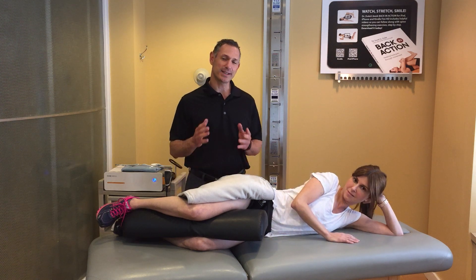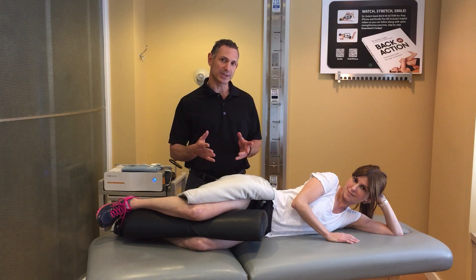Hi, I'm Dr. Duke and today we're going to go over how we use EPAT at Duke Chiropractic to heal different injuries. Today we're going to talk about a glute medius tear.